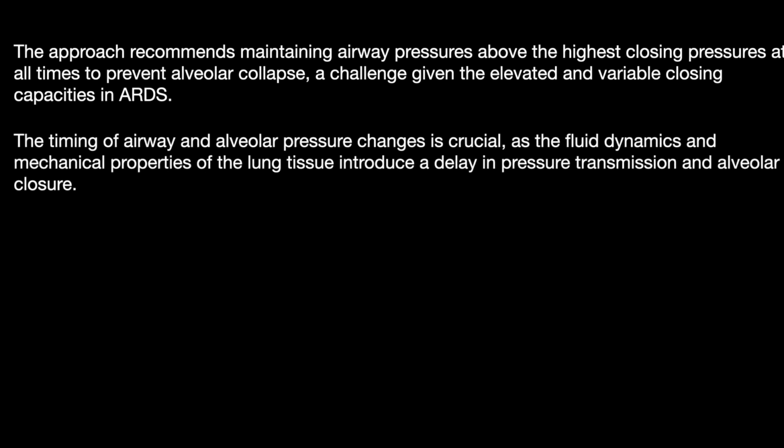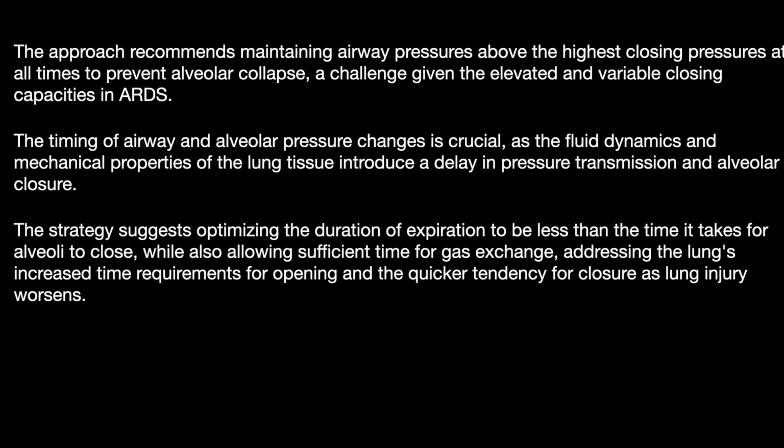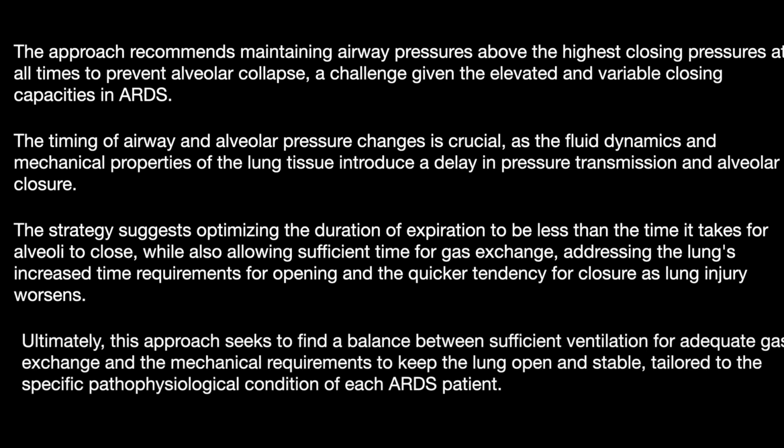The timing of the airway and alveolar pressure changes is crucial, as the fluid dynamics and mechanical properties of the lung tissue introduce a delay in the pressure transmission and alveolar closure. The strategy suggests optimizing the duration of the expiration to be less than the time it takes for the alveoli to close, while also allowing sufficient time for gas exchange, addressing the lung's increased time requirements for opening and the quicker tendency to close as the lung injury worsens.